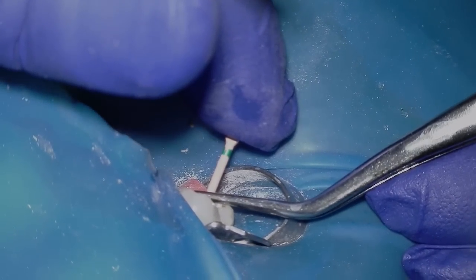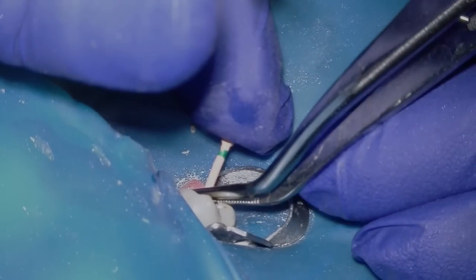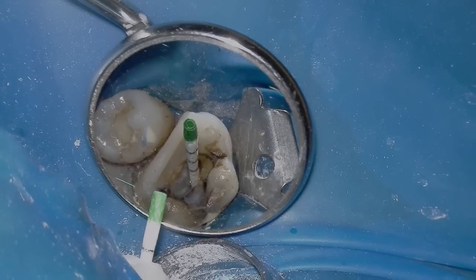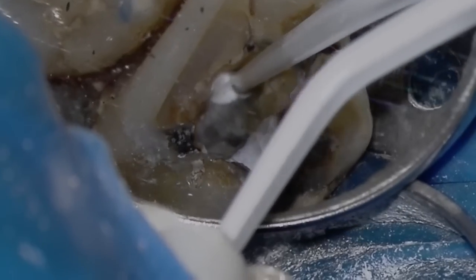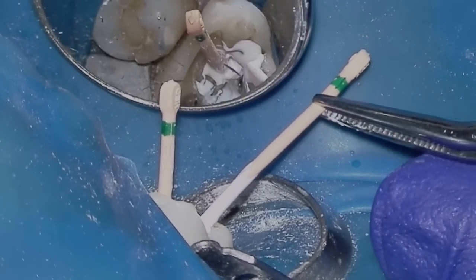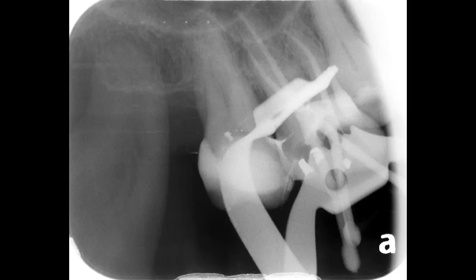We're going to fit our GuttaCore points and then complete our final irrigation protocol with sodium hypochlorite and EDTA. Time to dry our canals — a couple cycles of paper points. Now it's time to place BC sealer in the coronal half. We'll place our GuttaCore cones and take a radiograph to check our lengths. Looks good!